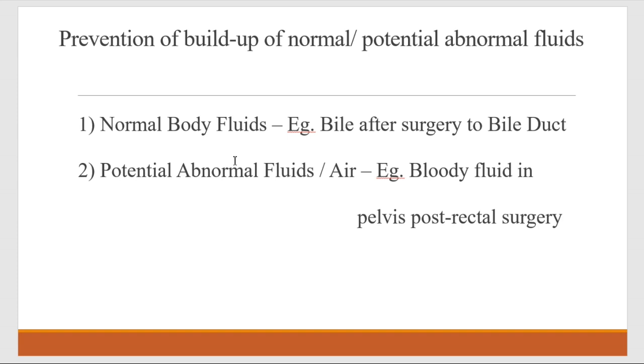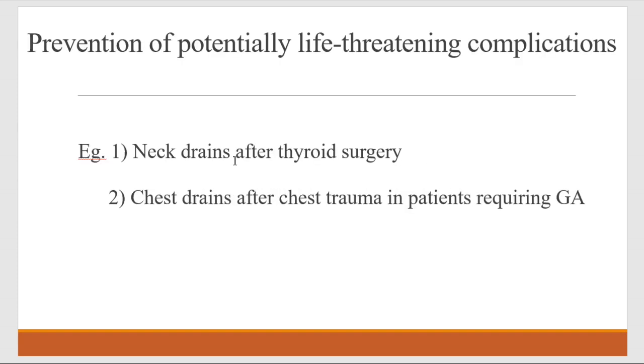So in order to remove it, we would like to put a drain there. The second one, prevention of buildup of potential abnormal fluids or air. For example, after any major surgery in the pelvis, such as total mesorectal excision, TME, or any other rectal surgery, if we want to drain out the bloody fluid that may be present in the pelvic area, for that purpose we can use the drain.